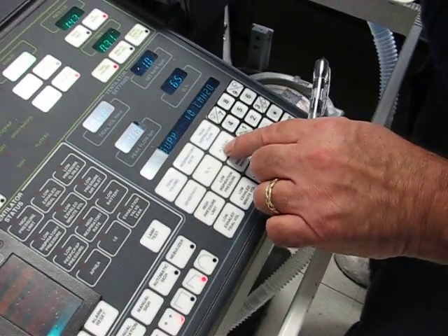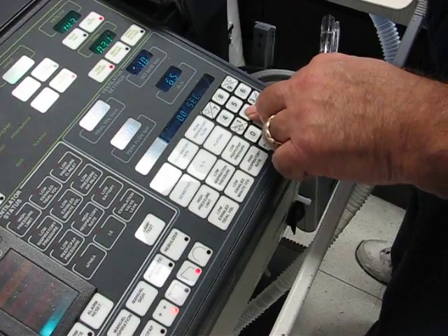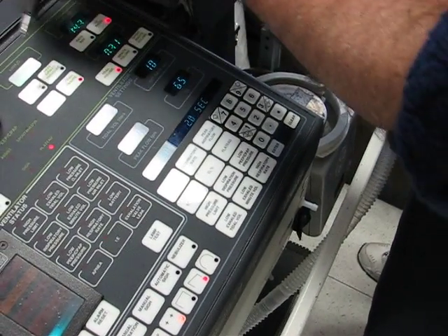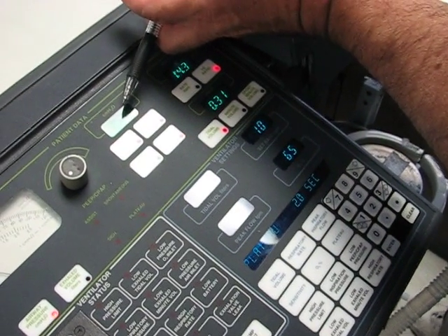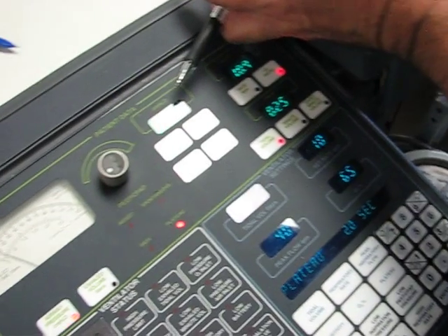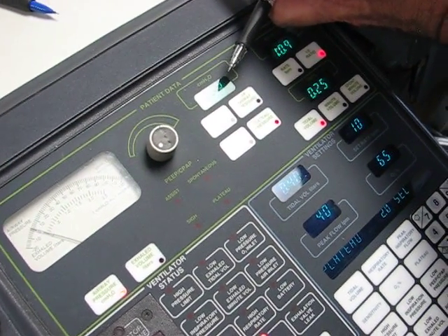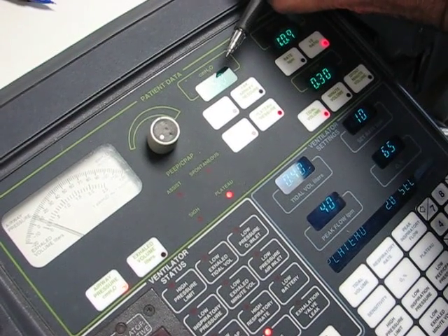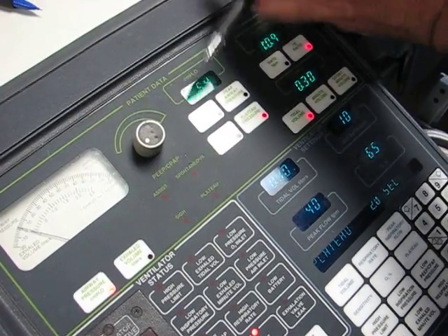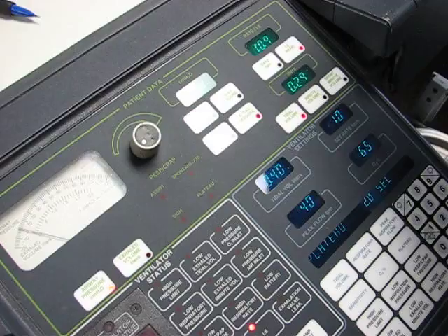So I go down here on the settings under plateau and I set in 2 seconds. So I hit 2, enter. And now when the vent cycles, it will put an inspiratory pause in and give me a readout. Now I'm going to wait for the second or third readout because usually it goes up a little bit higher each time. Okay, so it's going to be 5. So I would put 5 under here for plateau pressure.